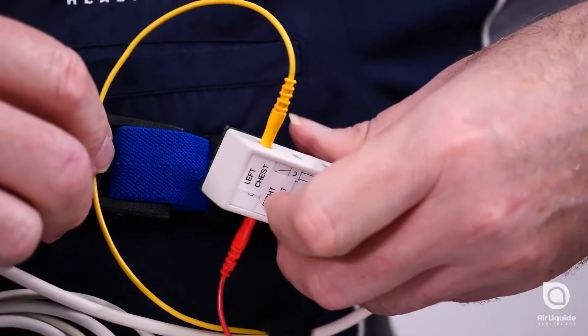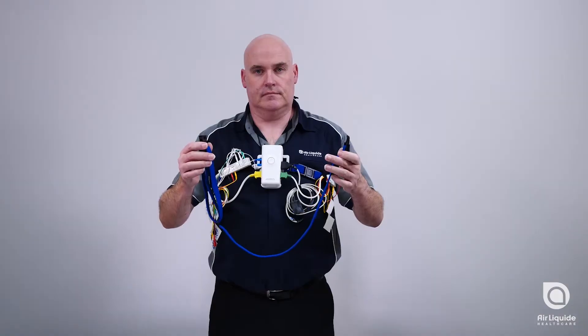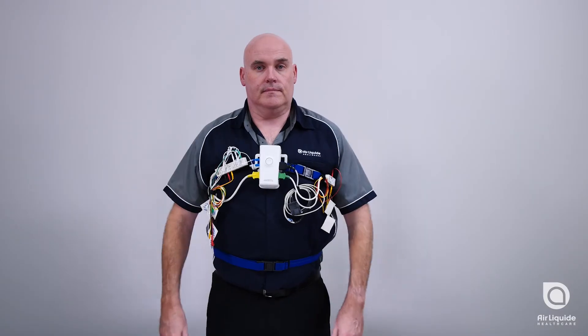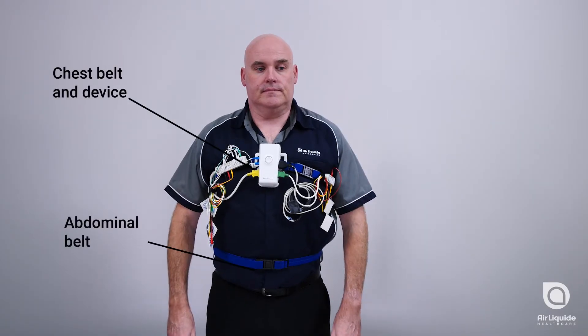Attach the ECG yoke to the Velcro wrap. Place the second belt around your waist with the plug holes facing upwards. This belt should sit near the belly button. Clip the two ends together to secure. Ensure that the bands are firm and not twisted.